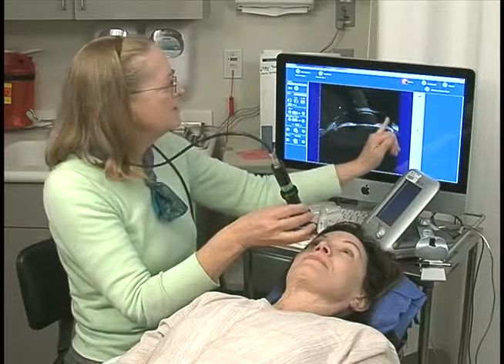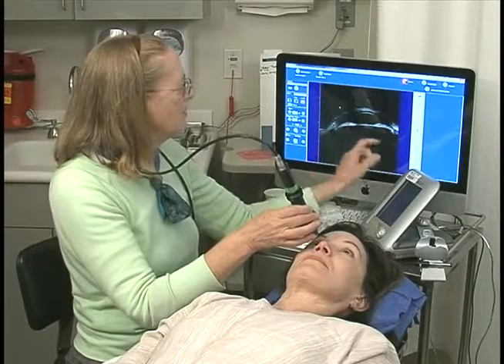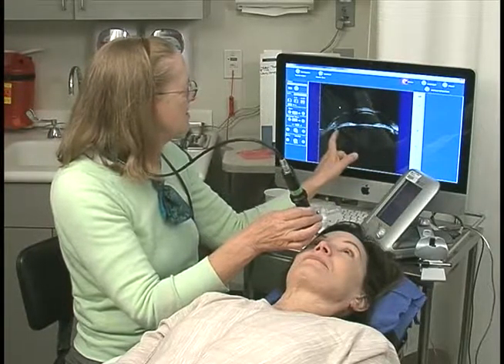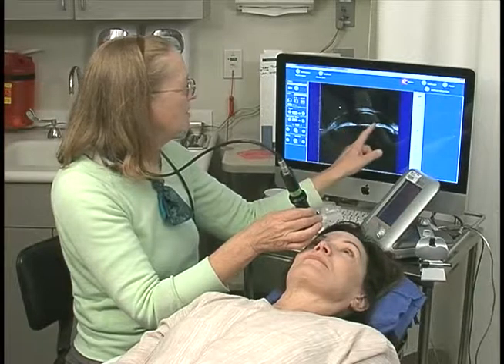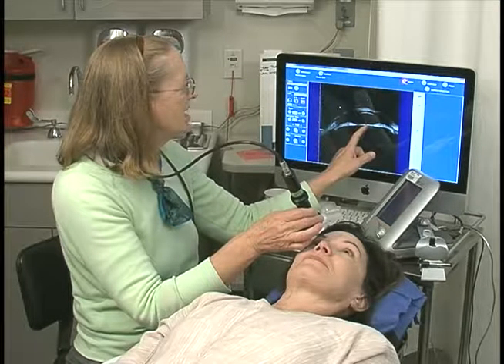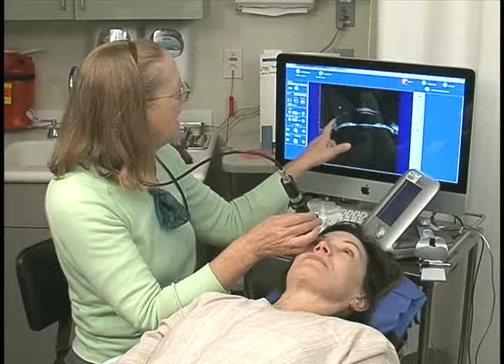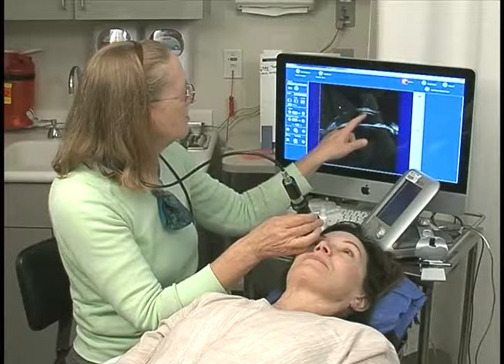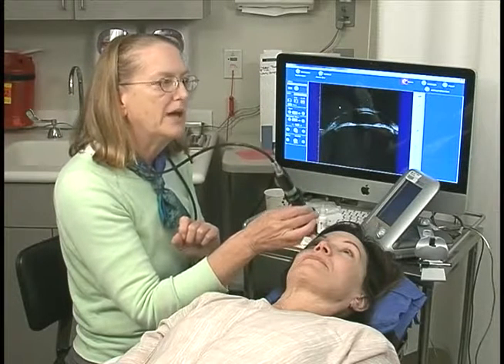So this is nasal and this is temporal. This is the nasal ciliary sulcus, the temporal ciliary sulcus, the pupillary space, the anterior lens capsule. You can see the bag and the anterior cornea and posterior cornea underneath the bag.